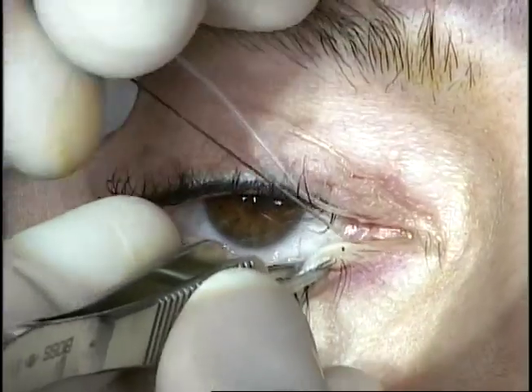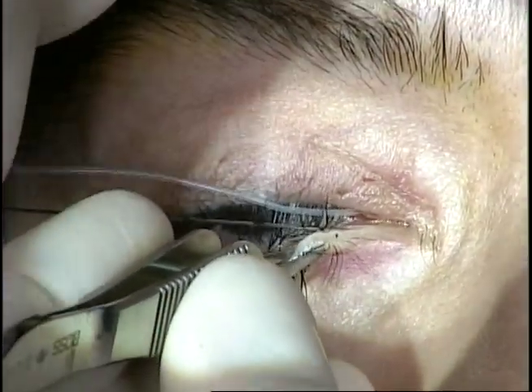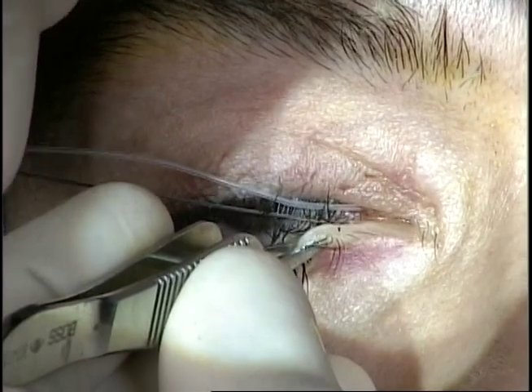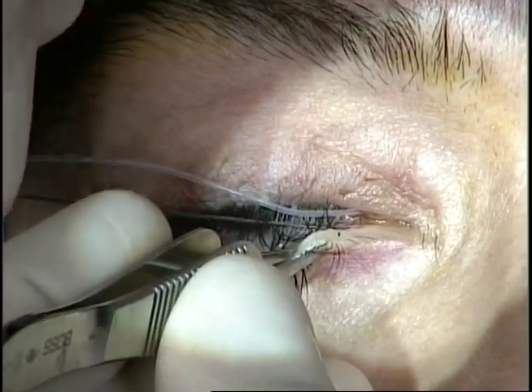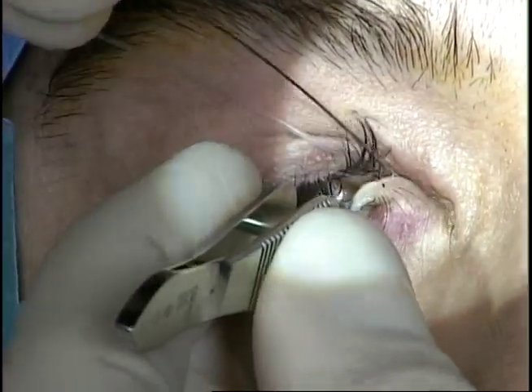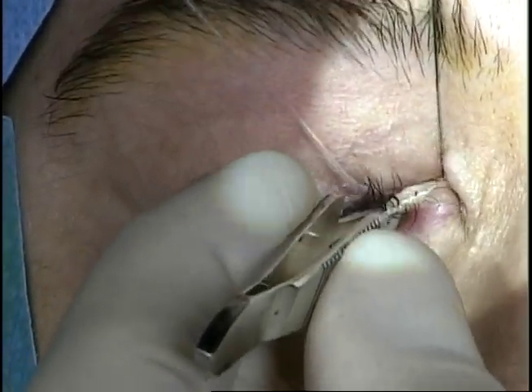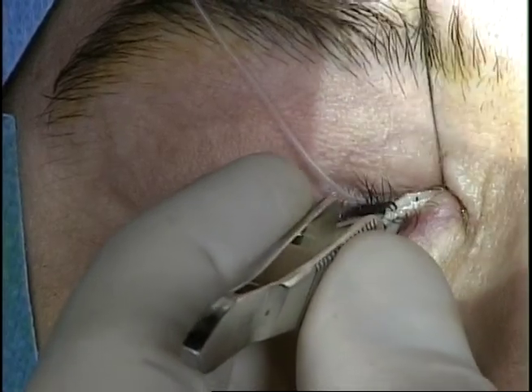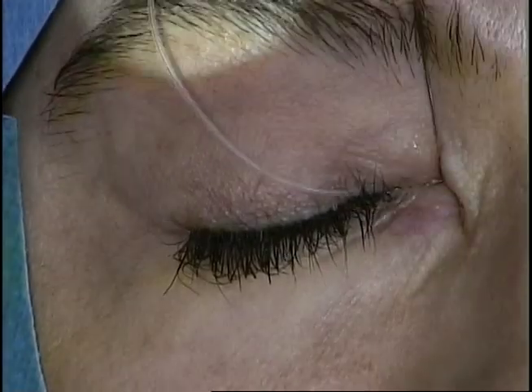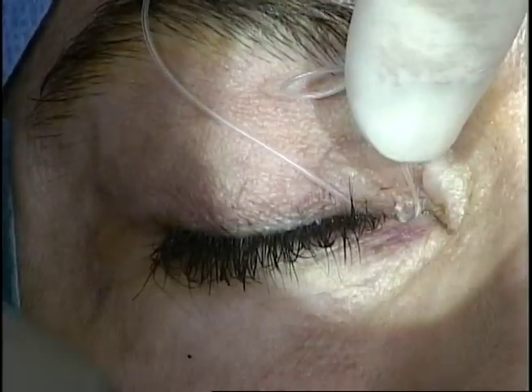The same procedure is then performed on the lower lid. A hard stop is appreciated, followed by rotation of the probe and advancement down the nasolacrimal duct. The stent is then retrieved from the nose.